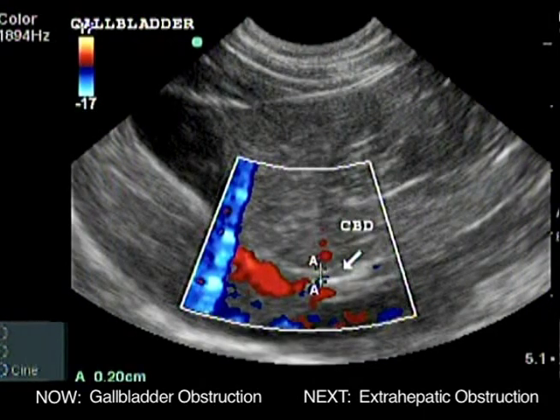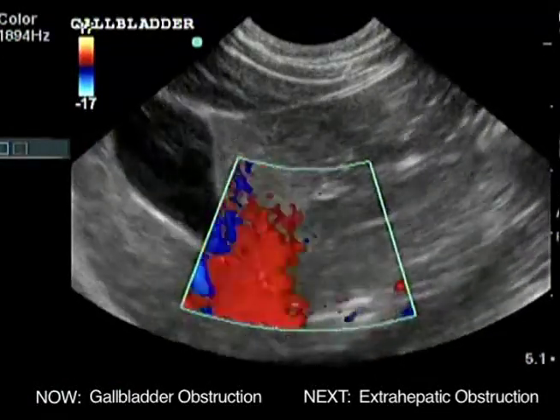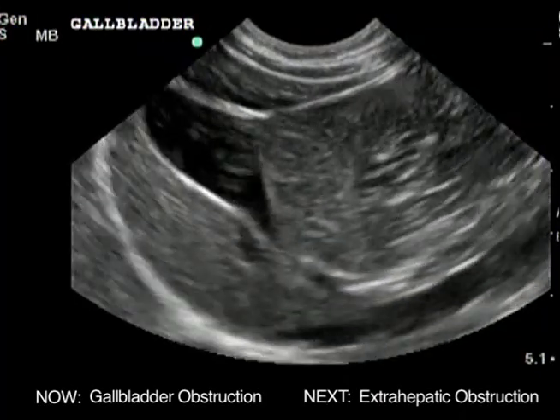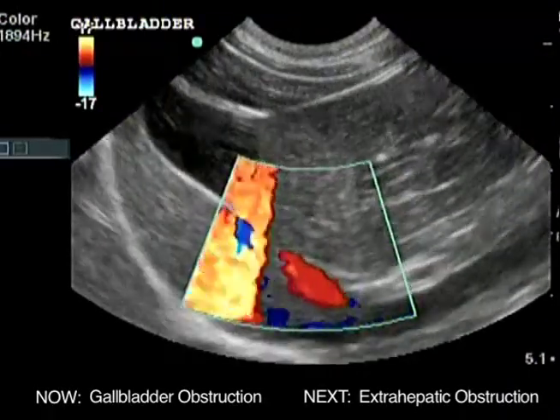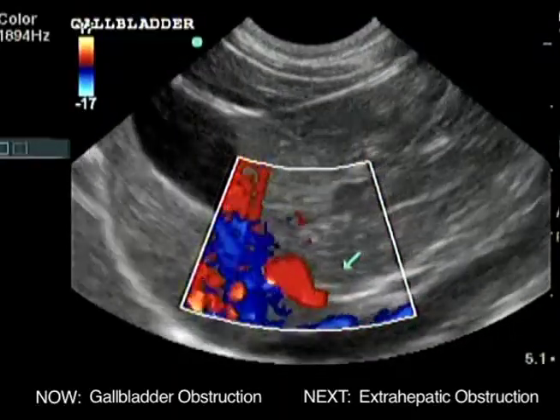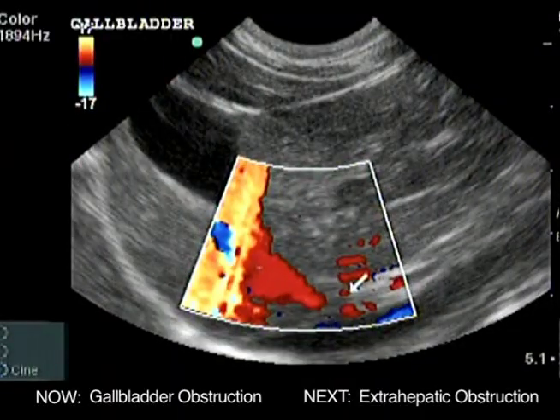In cats, the stomach usually ends at the ventral midline, and the gallbladder, cystic duct, and common bile duct are commonly seen. The gallbladder in cats usually contains 5 to 7 cc's of bile. Gallbladder volume of 10 cc's or more is considered to show obstruction in cats. The normal common bile duct should not be greater than 3 to 4 millimeters in diameter.